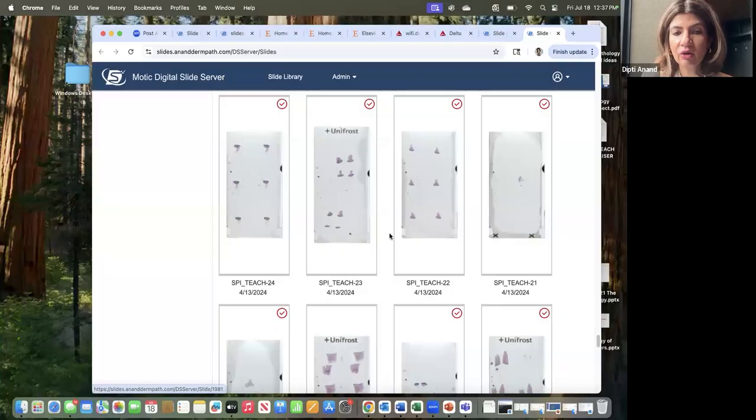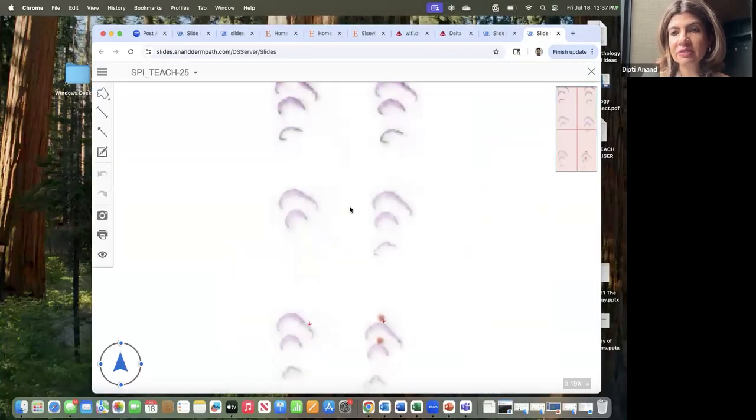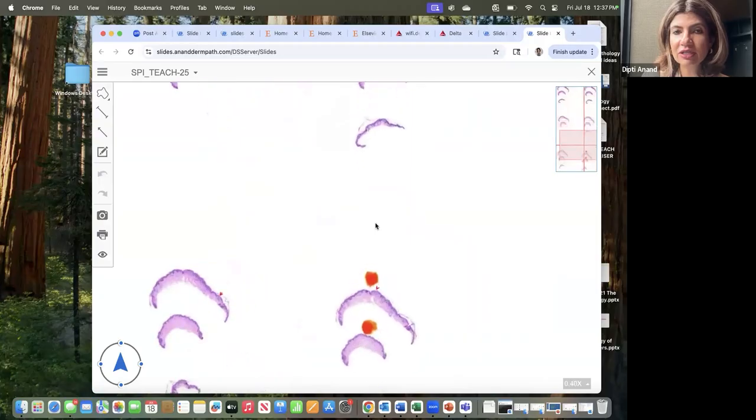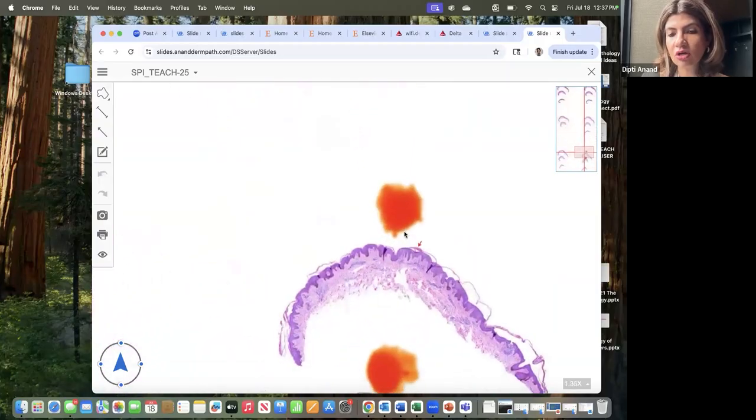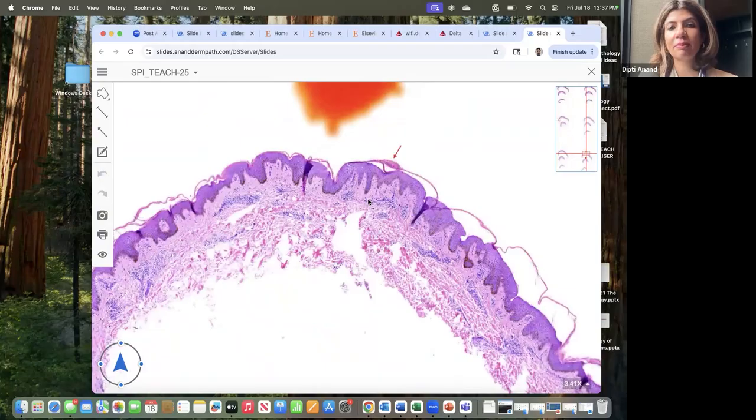Okay, now the next thing we are going to be talking about is pityriasis rosea. There are three pityriasis diseases which are all kind of complicated. We have pityriasis rosea, pityriasis rubra pilaris, and pityriasis lichenoides. We will be talking about all those three entities today. Those are important board entities, but they are entities which we do not always think about right away when we see a slide, so you should remember them.